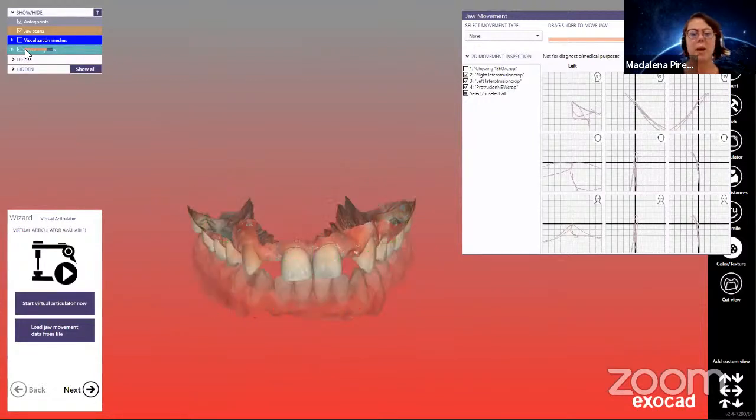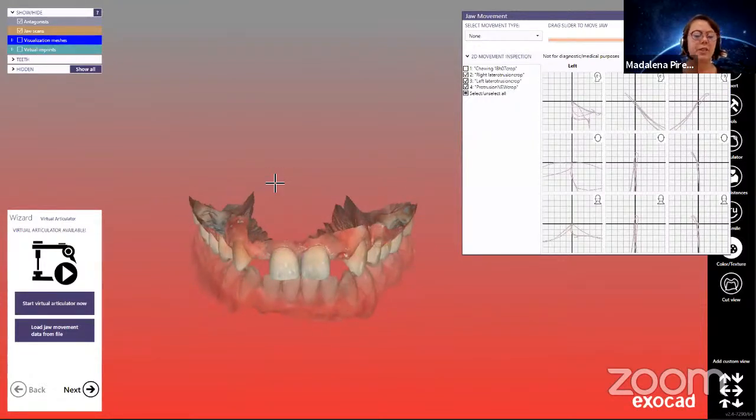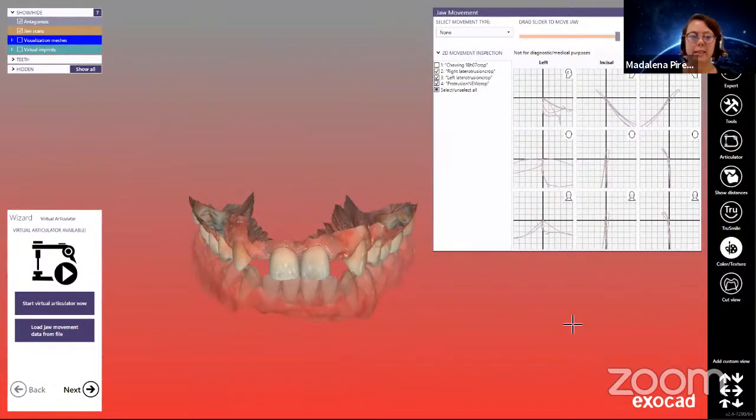So there's many ways of using this data, if it's digitally or even just with the traditional methods. There's still a lot of dental technicians who finish everything by hand. We make custom-made medical devices. When we go into, for example, anterior teeth, there's a lot of finishing to do by hand that the machines cannot do. So we have a lot of solutions here to use the data till the end.